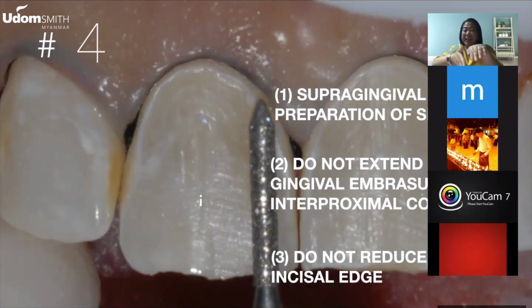In my first case, I removed the contact because that is what I'm used to. But with Edelweiss, if there is no need for tooth preparation, then you just have to roughen the surface. That's it. And then create a certain supragingival shoulder, so that when you place Edelweiss, the junction between the tooth and the Edelweiss is properly done.